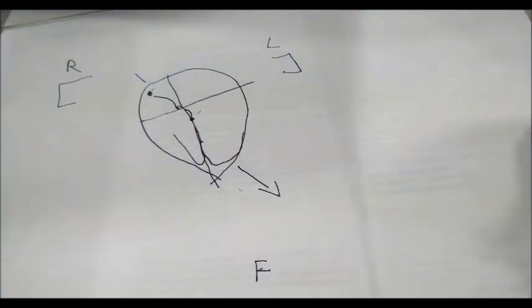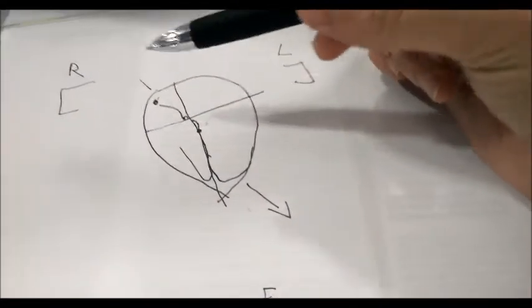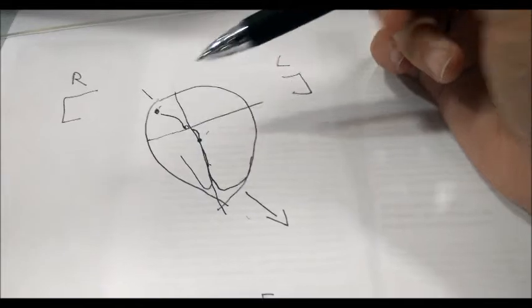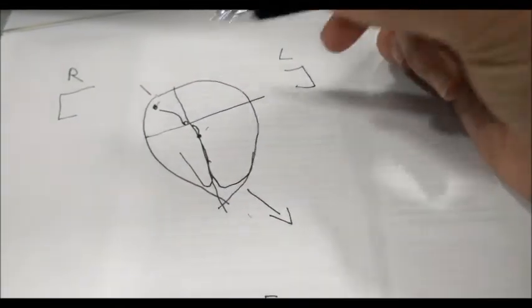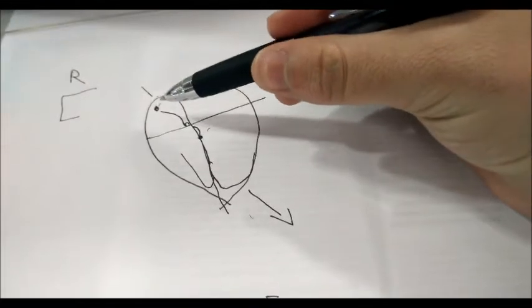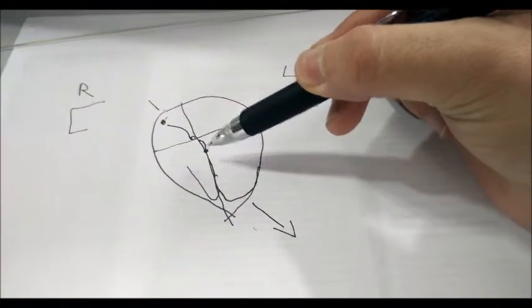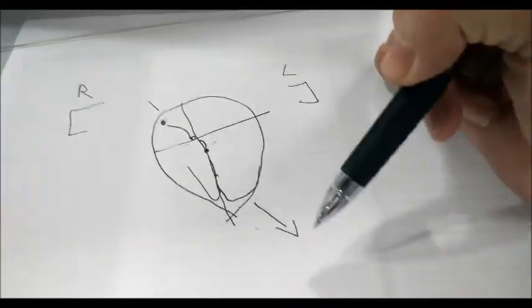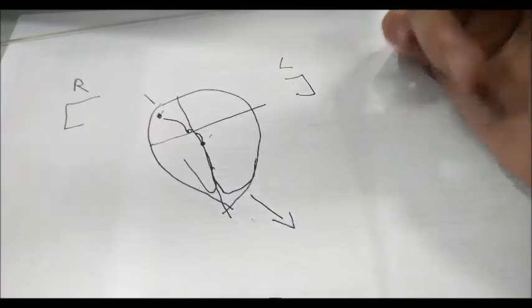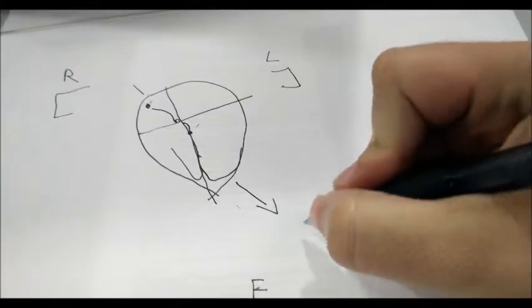Now why is this important? Well, it's important because it goes with the heart anatomy. When you look at an EKG, you want to understand what the EKG is telling you about the heart anatomy. And I'll go more in depth on that in just a minute. Anyhow, you have your SA node going to your AV node, from your AV node to your bundle of His, from your bundle of His to your Purkinje fibers, all in what is called a diagonal fashion, which in this particular case, we're talking about our normal axis deviation.